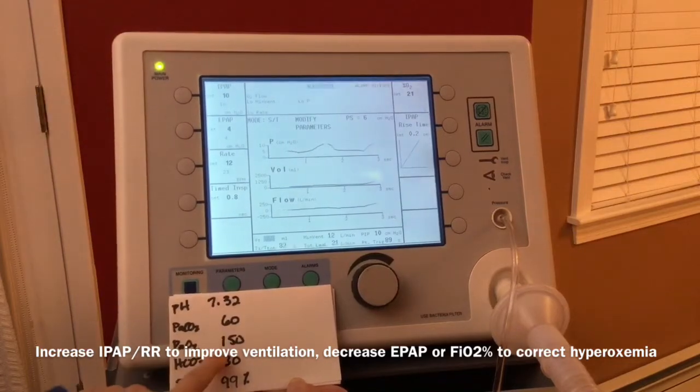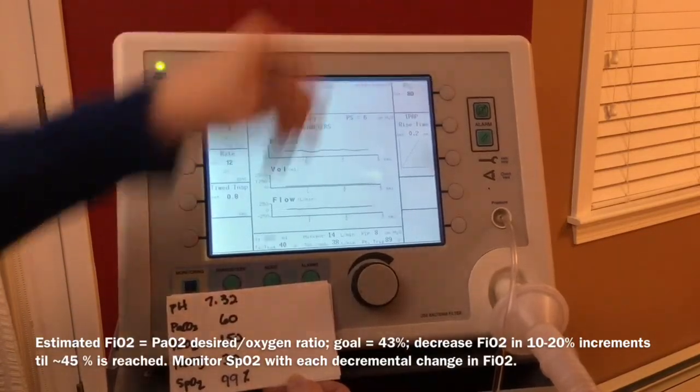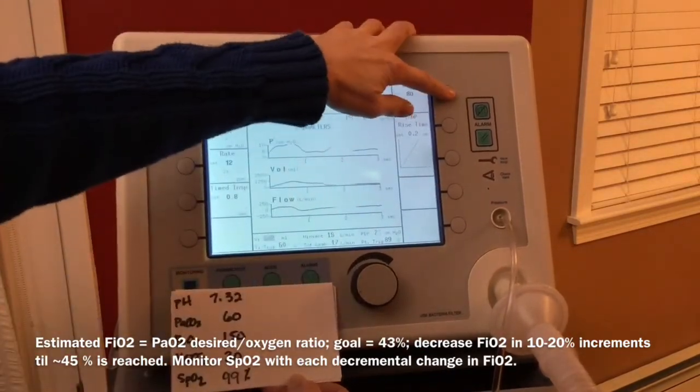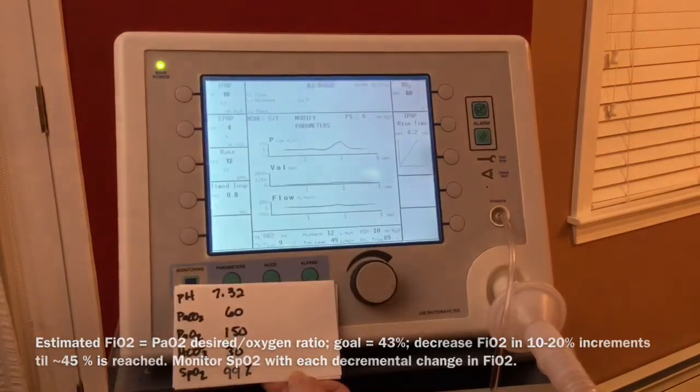The patient is hyperoxemic, so the FiO2 must be decreased. If our patient were on 80%, we could drop the FiO2. In this case, I would go to 60%.